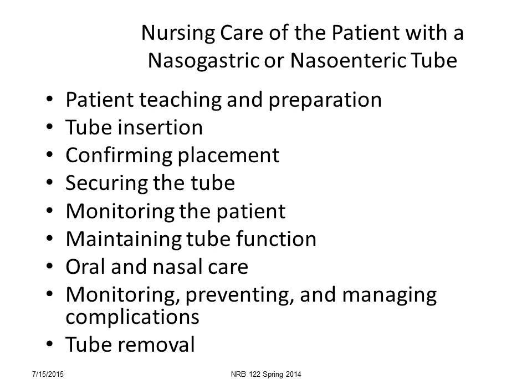If the tube is put in there for suction, is it indeed suctioning? Is it working appropriately? If we're using the tube for feeding, are we irrigating it? Are we putting the appropriate feeding in? Are we monitoring the patient appropriately? We want to give frequent oral and nasal care, and we want to monitor, prevent, and manage any complications. Now, nurses put these tubes in, so nurses will be removing these tubes as well. And as students, you can be putting these tubes in and you will be removing them.